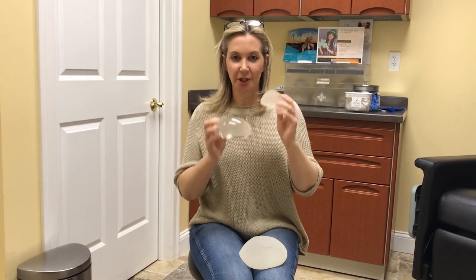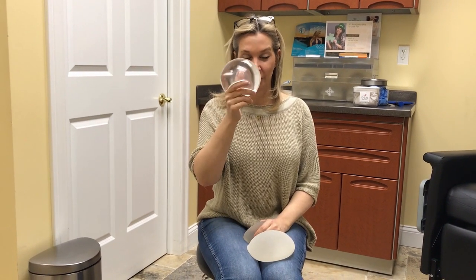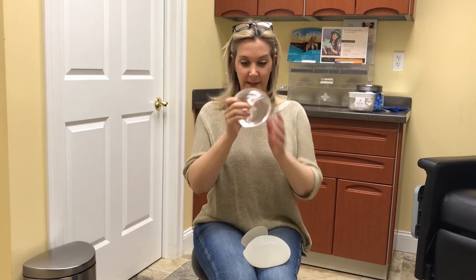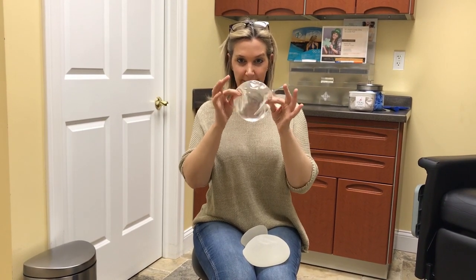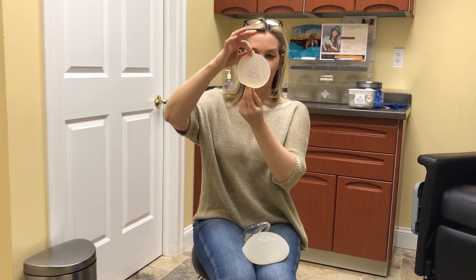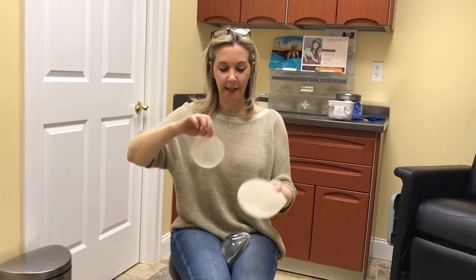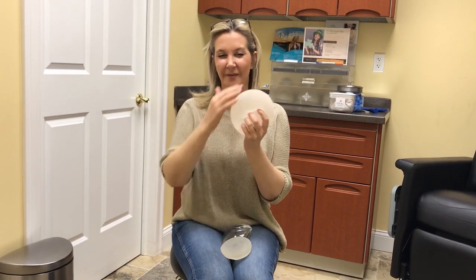So there's a lot of different kinds of, we're going to just talk about gel implants now. There are a lot of different types, shapes, sizes, textures of implants, and I'm going to explain to you why I pretty much always use a silicone round gel implant. This is smooth, round gel. This is a shaped implant. A lot of times people would consider that a gummy bear implant. I never use these for several reasons. I'll explain it. And here's just a textured implant. If you felt this, it's not smooth.